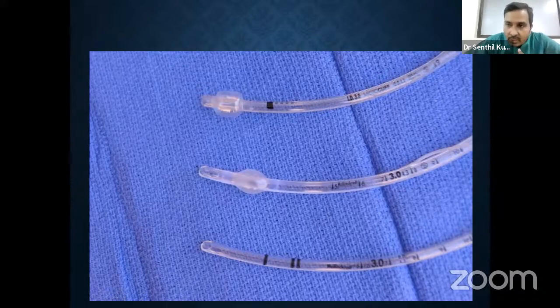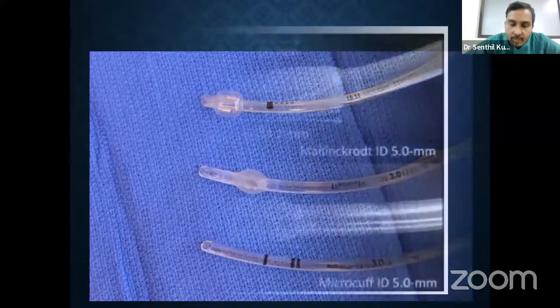That is also one reason for the reduced chance of reintubation. The study shows that the chance of reintubation is very, very low with a micro cuff tube, and also in the post-extubation group. So remember again, when you are using nitrous oxide in pediatric patients with a cuffed endotracheal tube, irrespective of whether it is a micro cuff or normal tube, we are supposed to monitor cuff pressure periodically.